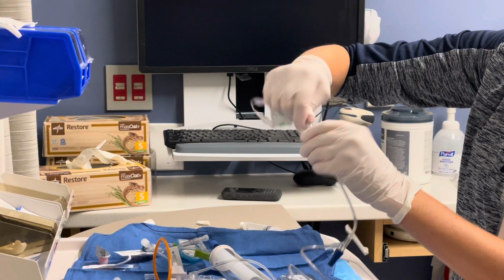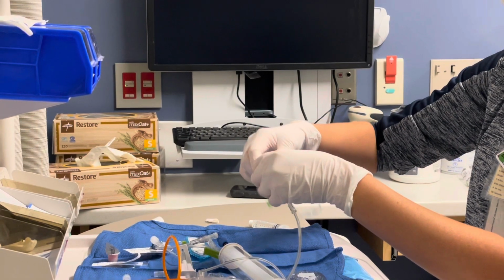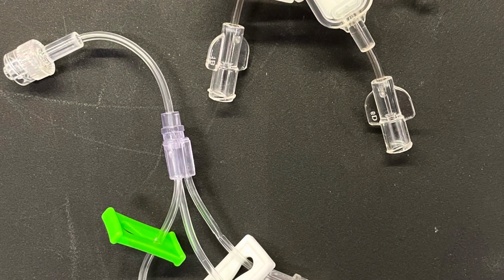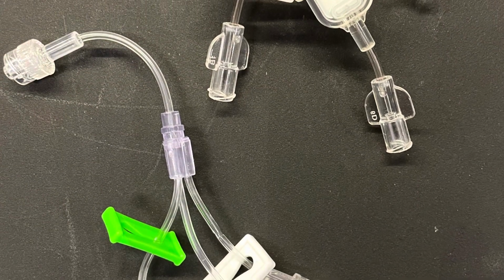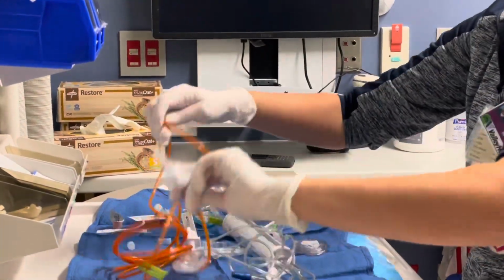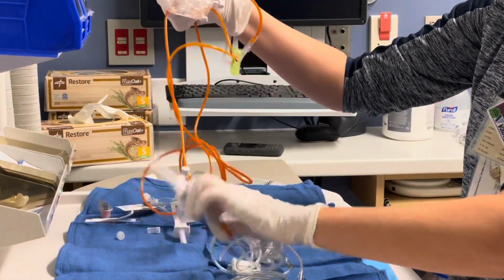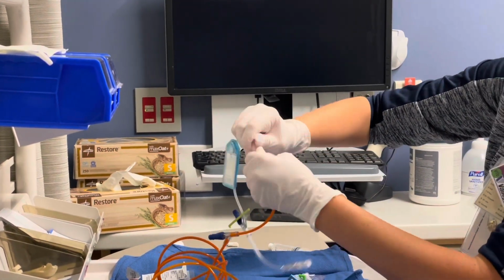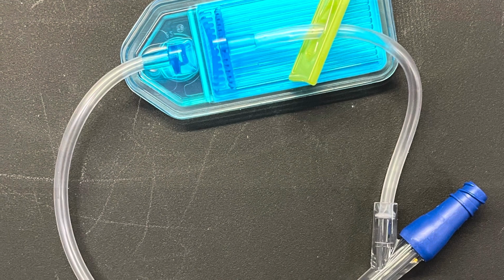Emily is now connecting her 3-way extension tubing to her maintenance IV fluid. In this case, it's TPN. Any maintenance fluid will need a filter attached. This is an example of our 3-way extension set. As supplies change, the item may look different. Our lipids need a specialized tubing to protect them from light, as well as a specialized filter. Medication lines do not need a filter, as this will filter out your meds.